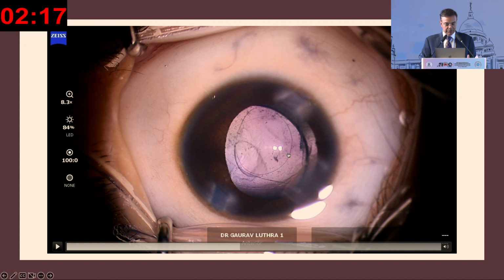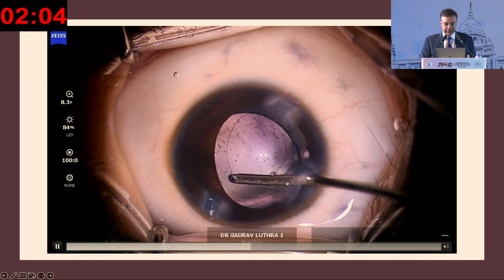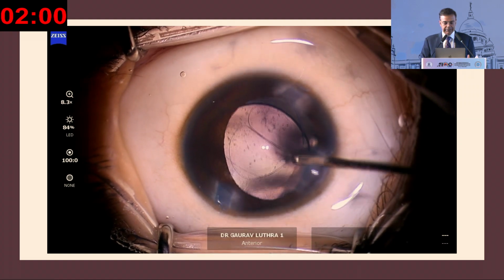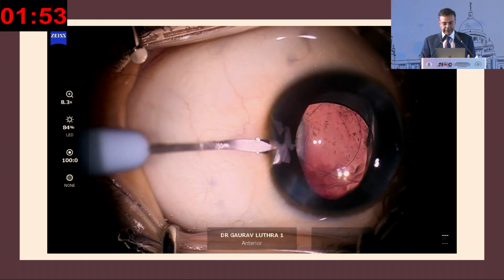The rhexis is too small for me to manipulate it out very easily, and the lens, the optic, has gone behind the PC, actually in this area. It may not be visible on the video right now, but there's a big PC break like this all across. So what I do is, I now need to enlarge my rhexis. So I just give it a small snip because I want to get this optic anterior to the second snip on the other side.